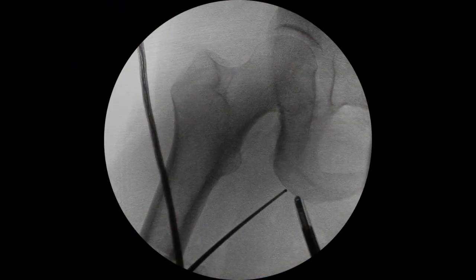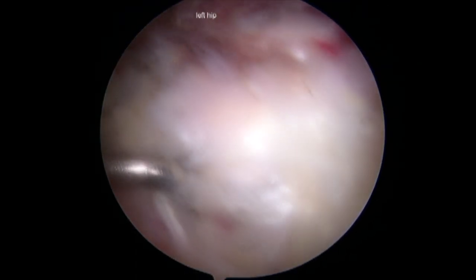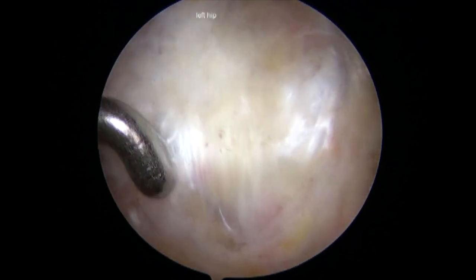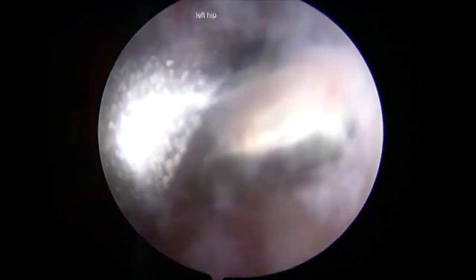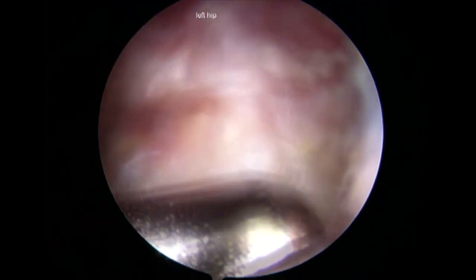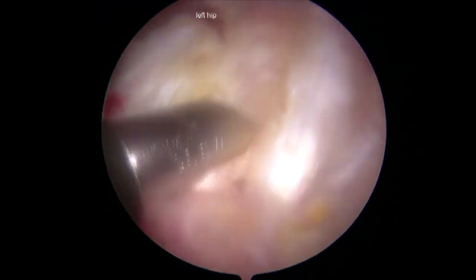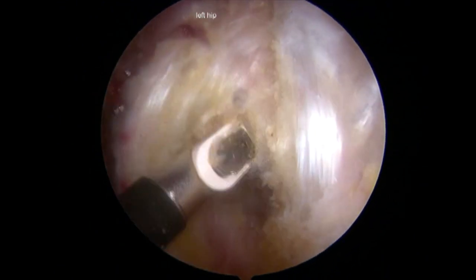A probe was inserted and used to identify the laminated portion of the conjoint tendon where the high-grade partial thickness tear was seen. The probe was also used to identify the defect in the hamstring tendon, and the shaver was used to remove bursa for further visualization. The tendon was then split where the high-grade undersurface partial tear was identified, and delamination was visualized on the inferior portion of the screen.